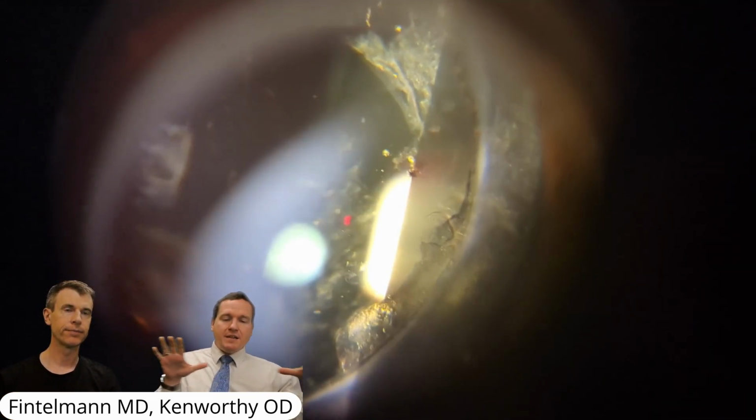So those cells are just looking for any potential space to slide across, like you mentioned, vitreous, most of the time capsule, and in this case we're suspecting it's on the actual lens, where it's moving across. And it still can be treated with a YAG, so recurrence is a fair term because it's treated in the same way. Got it.